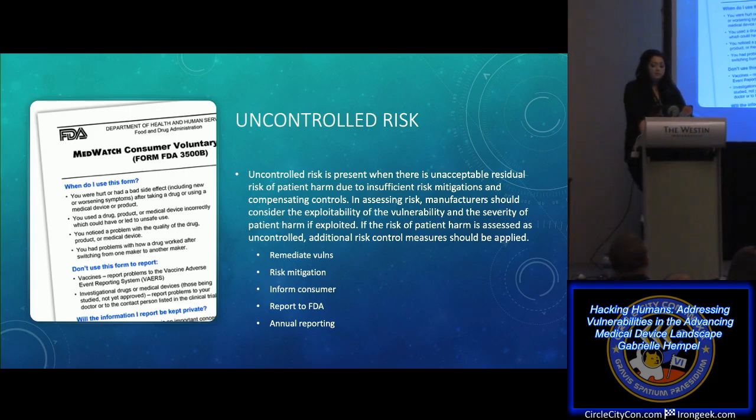A hospital submits a report that a patient was harmed after a medical device failed to perform as intended. Upon investigation, it was determined that the medical device malfunctioned as a result of exploitation of a previously unknown vulnerability in its software. The outcome of the investigation and impact assessment determines that the exploit impacts the device's safety and essential performance and could have contributed to the patient's death. A report is filed in accordance with the reporting requirements, and the manufacturer notifies its customers and develops a validated emergency patch to remediate the issue.